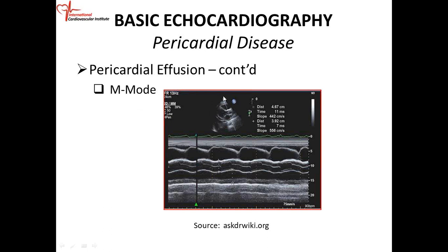You always have to do this because it's very evident when you do your M-mode echo. So you can see the structures. The cursor is located here. It passes through the chest wall, the portion of the pericardium, the pericardial fluid, the RV wall, the RV cavity, the wall of the aorta, the aortic valve, the left atrium. So these are the structures that the cursor passes. Okay, and these are the same structures you're going to get in your M mode.